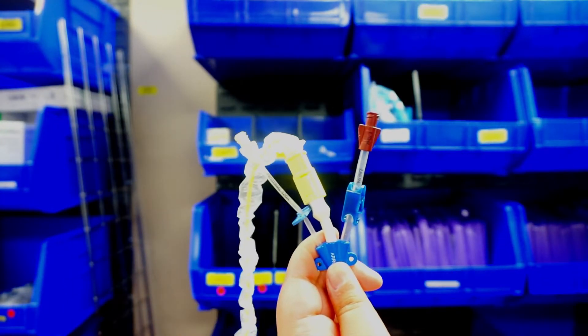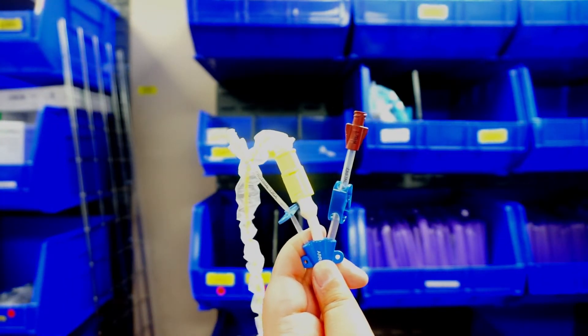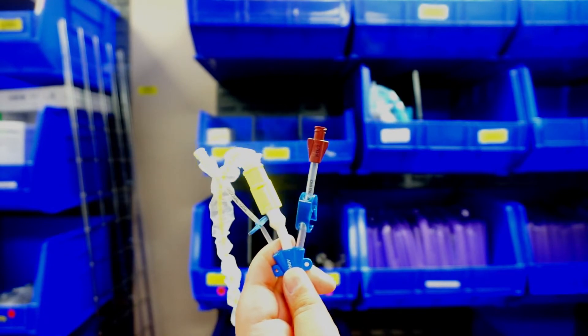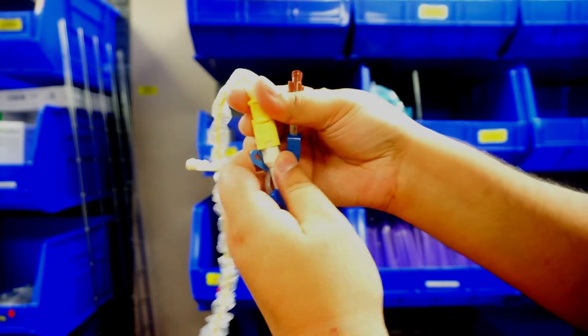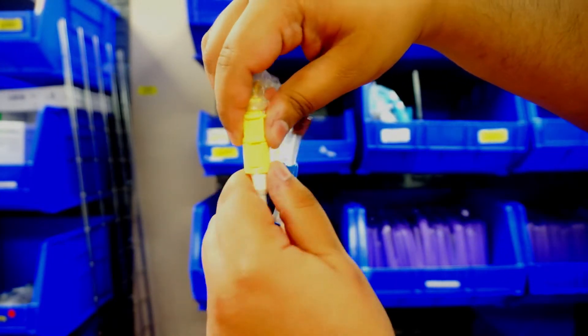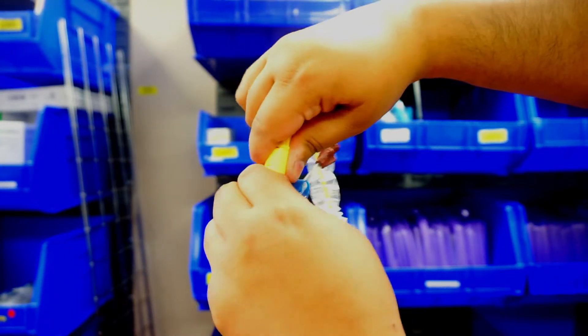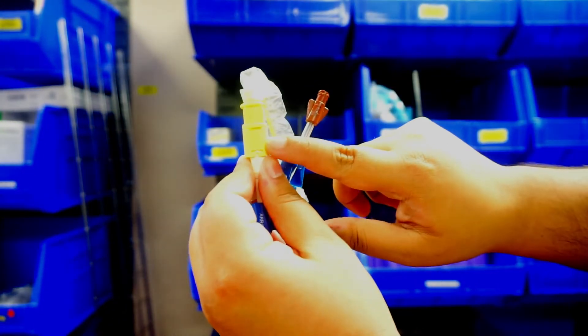And at this point, we're going to start, if you need to start taking off your dressing to get the Swan out, go ahead and do so. We're going to come over where this white divot is and we're going to twist it so it's in the middle, like so.